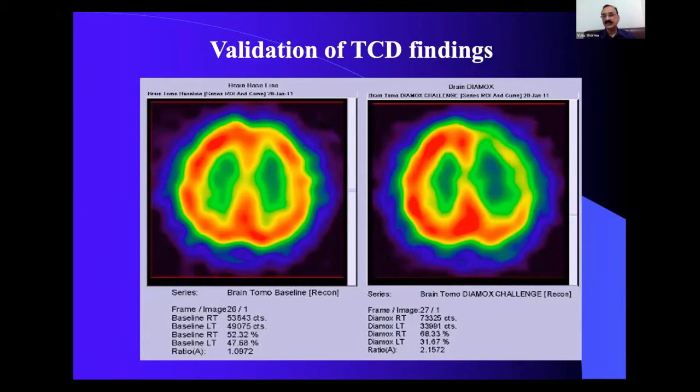So you can take the patient for additional investigations, like this acetazolamide challenge SPECT. You can see at normal baseline, there is a little bit of reduced metabolic perfusion in the left hemisphere. But once you give acetazolamide, see, there is an absolute steal. It is almost like 30% steal magnitude. So you know that if this patient gets a stroke, this is the size of the stroke which is going to be. And this is why this patient is getting up every day morning with headaches, because of severe vasodilation of meningeal collaterals. And once the carbon dioxide is washed out, this patient is fine.